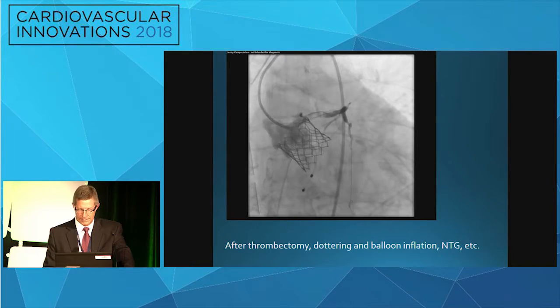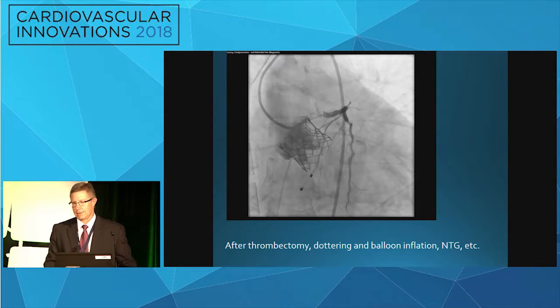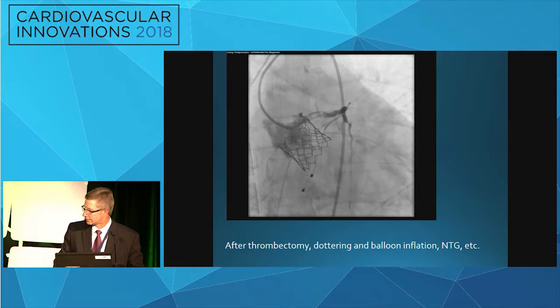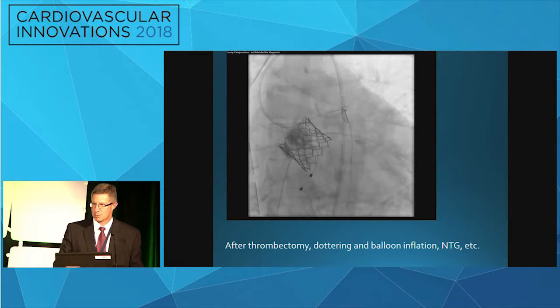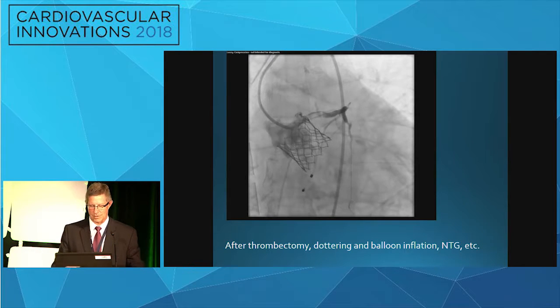Samir just talked about the guideliner. I think that's great. That's especially clot, though, right? You think that's embolization? No, I think that one's clot. But it's hard to tell. Well, but you're above the cage. Yeah, all my previous experiences with valve and valve tissue, so I always suspect valve tissue. Maybe I embolize it, maybe something else is going on. But I think this one was clot.